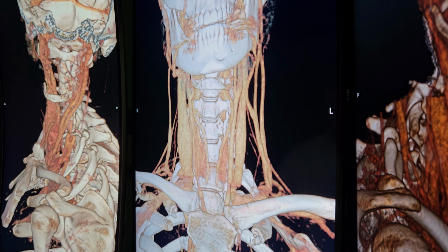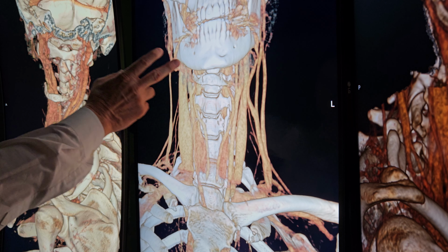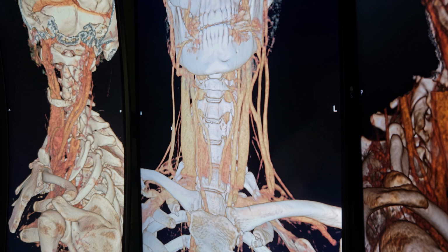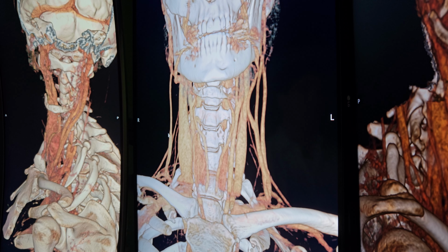So you're asking a good question. I don't know that I can answer it very well yet. But look at the fact that the hyoid is crooked and pulled back. And we're seeing evidence of contractures throughout the anterior compartment of the neck.